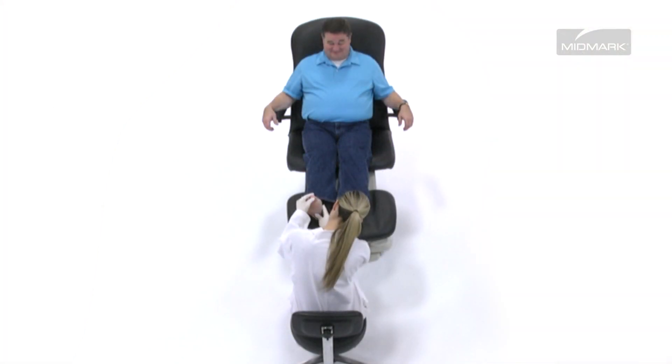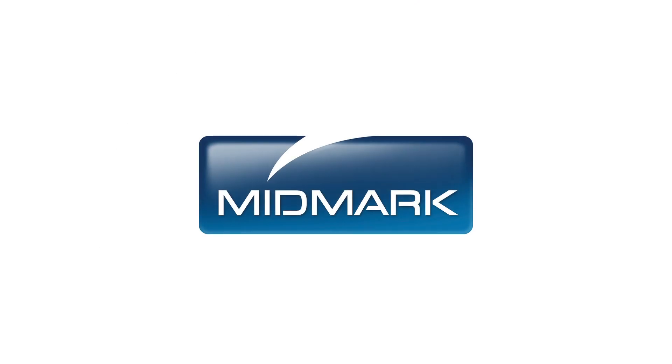Giving you the ability to access the foot and ankle area from multiple angles. For more information about the many benefits of the Midmark 647 Barrier-Free Power Podiatry Chair, call 1-800-MIDMARK or visit midmark.com.